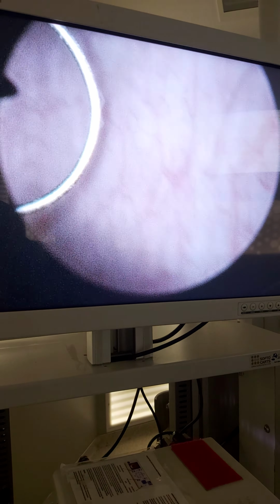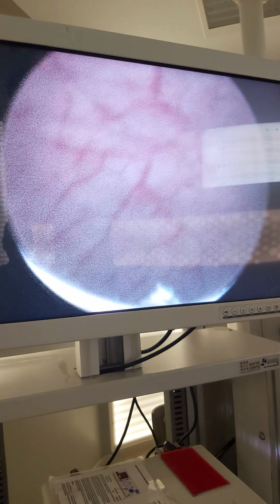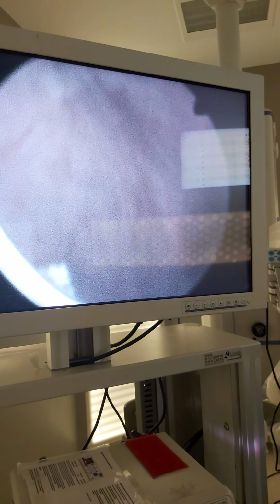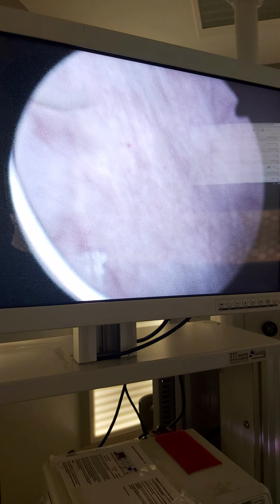So what's the solution? So you see the epithelium is very ill. So the treatment will be a little longer treatment course. Always look at these bleedings here. Okay, this is because I scraped these parts. And here, the first part I do scrape. There's not too much bleeding. I am scraping these tissues to let new bladder mucosa formation.